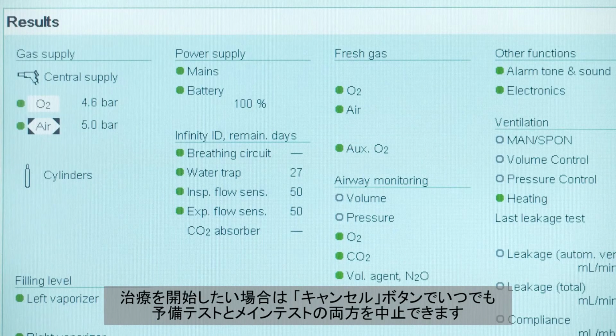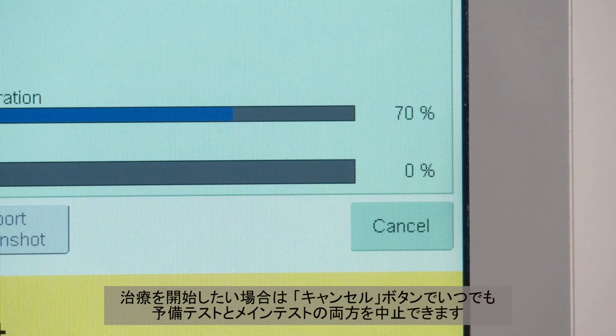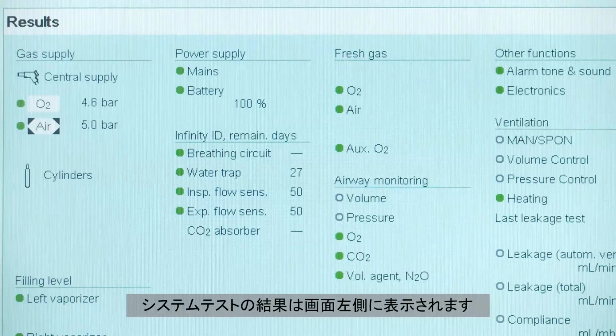You can abort both pre- and main test at any time using the cancel button if you wish to start the therapy. The results of the system test are displayed on the left side of the screen.